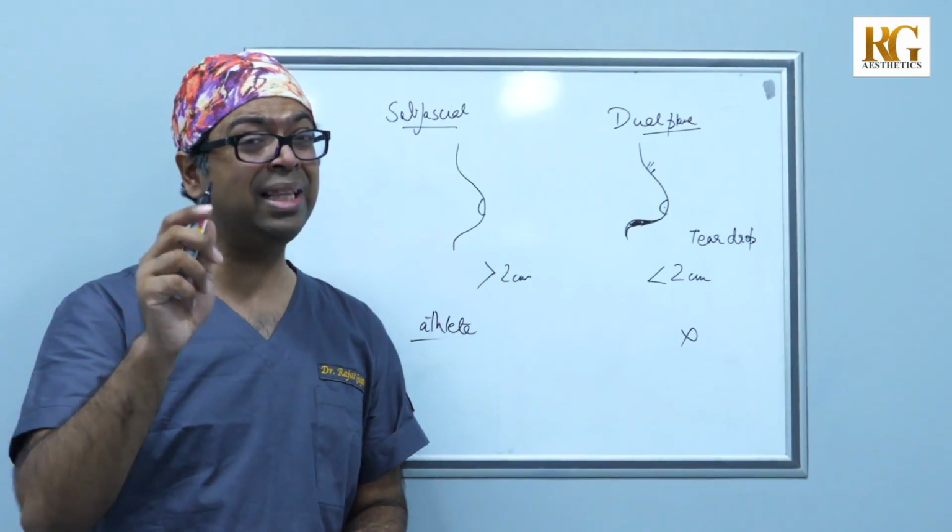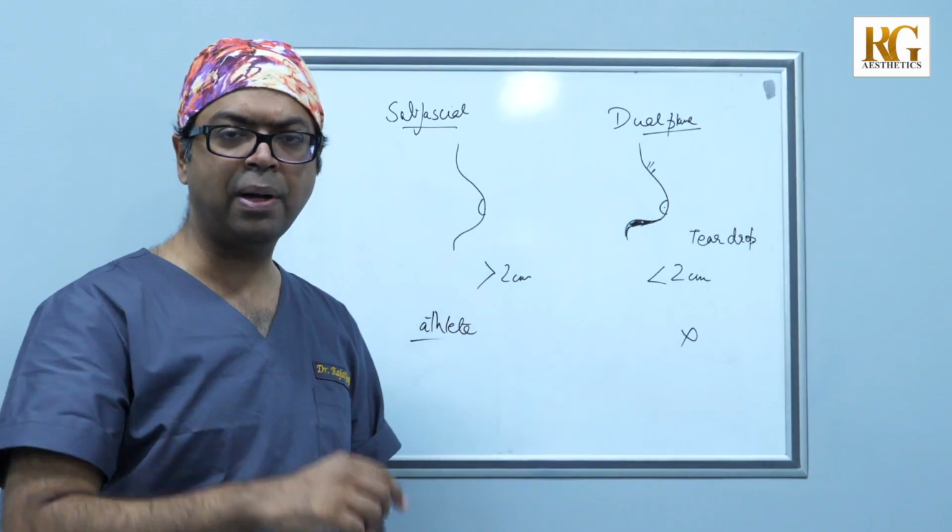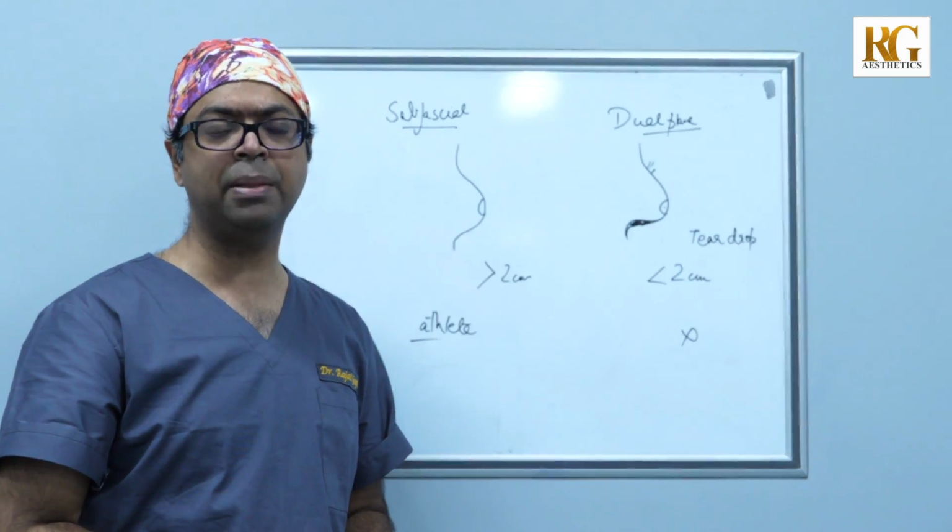Make sure you know all these differences. Make sure you discuss about these planes with your plastic surgeon who you're contemplating about breast implant surgery.